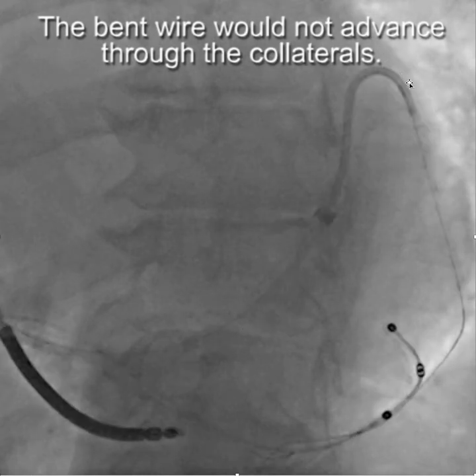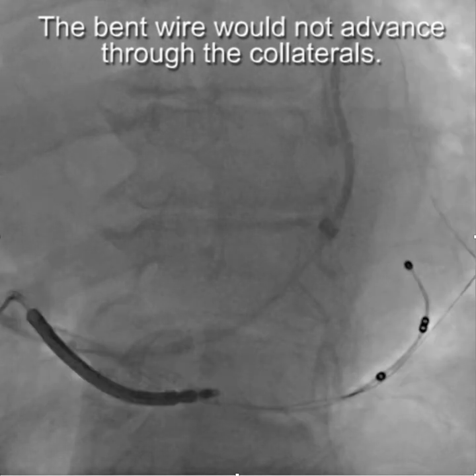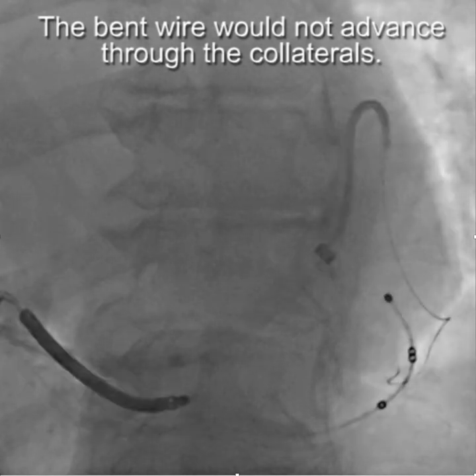So in this case, we had the wire through the collaterals down to here, but we couldn't get it to go back into the coronary sinus. You can see that the wire is bent as a result of traversing the collaterals, and this is an old LV lead. One of the things you learn is that you don't necessarily get the wire back through the collaterals.